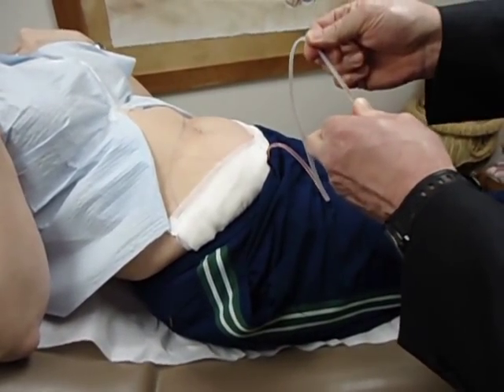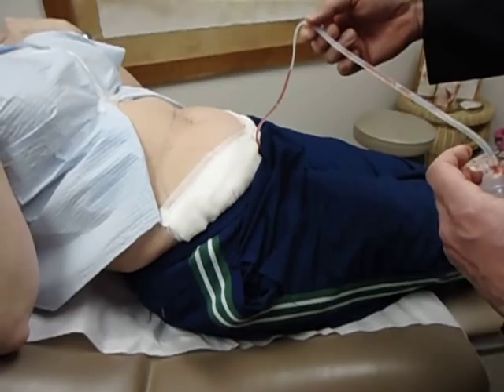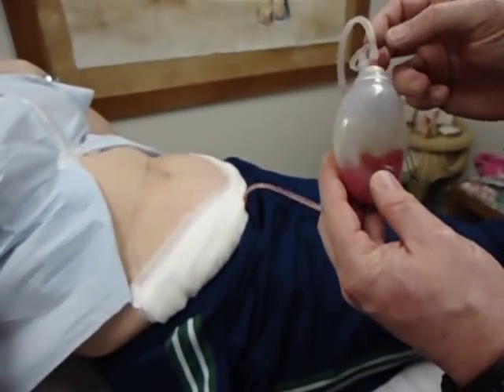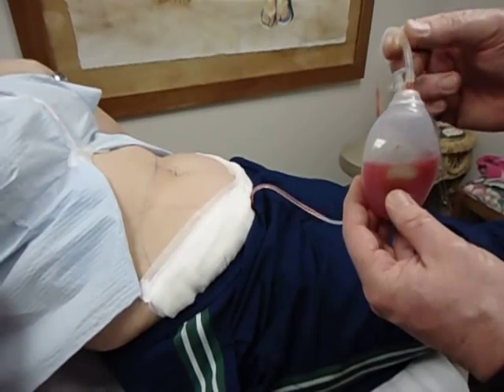Notice that at the end of the stripping, often times the tube is flat, clear, and collapsed. That will fill again, and any clot may have made its way down to the bulb, which will open up the tube and promote drainage.